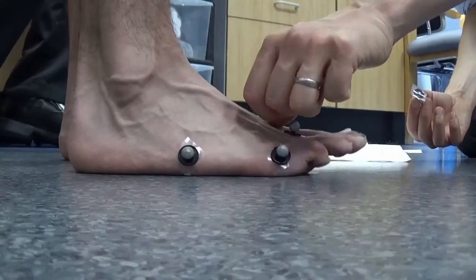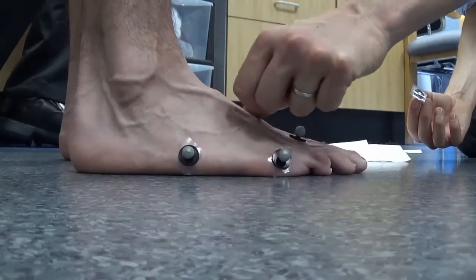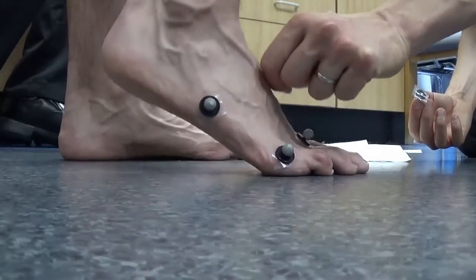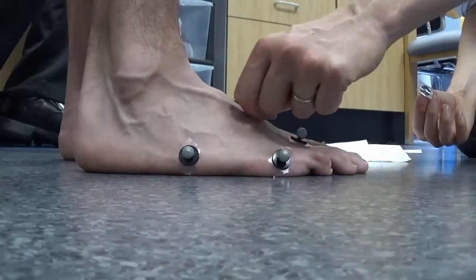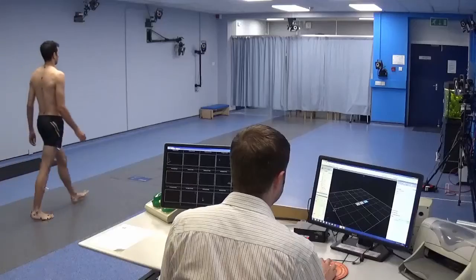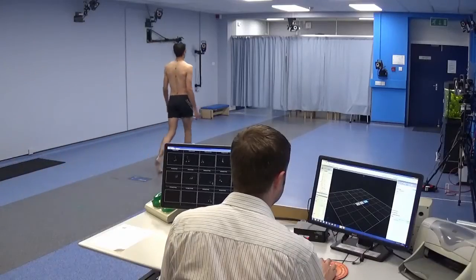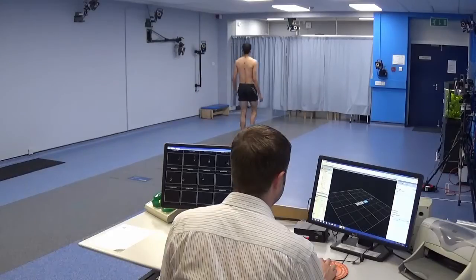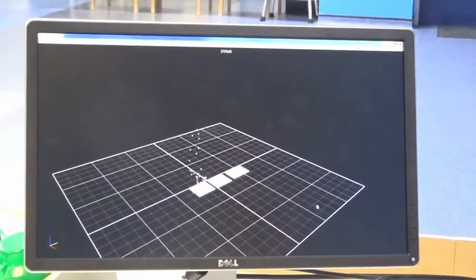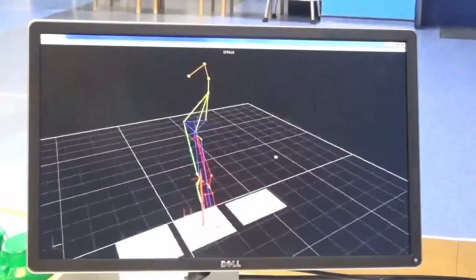Knowledge of these joint angles, known as kinematics, combined with the forces in the joints, known as kinetics, is what the clinicians require in order to make treatment plans. When the patient walks along the walkway in the lab, the trajectories of all the markers are being recorded with the 16 infrared cameras mounted on the walls.